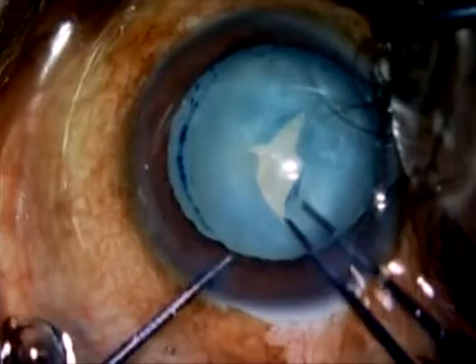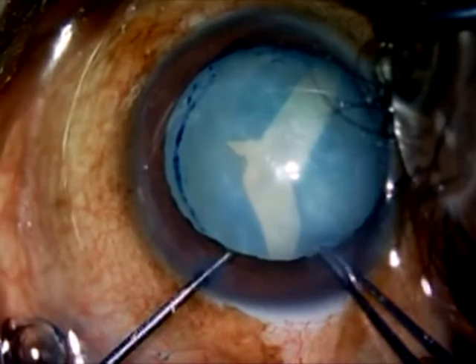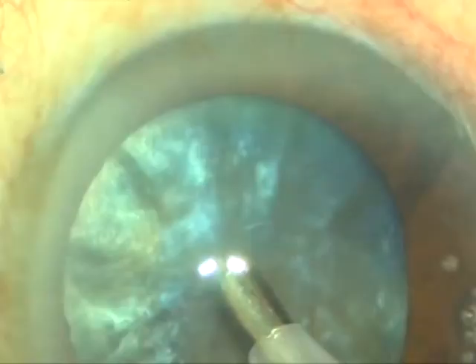To prevent the Argentina flag sign, a new technique called panchorexis has been developed. What is panchorexis?